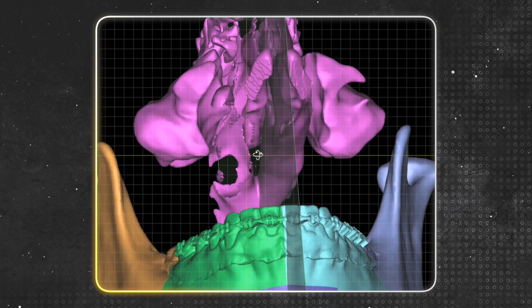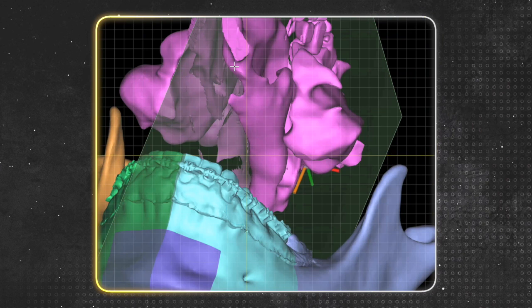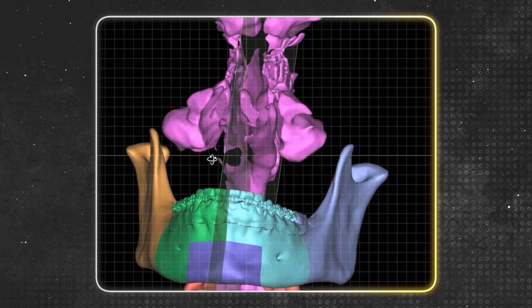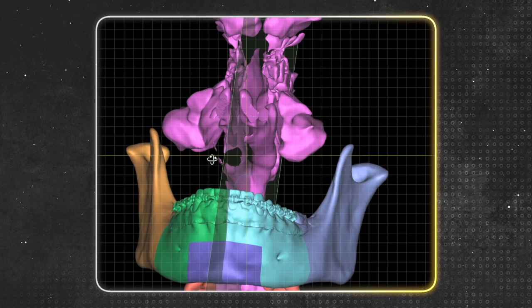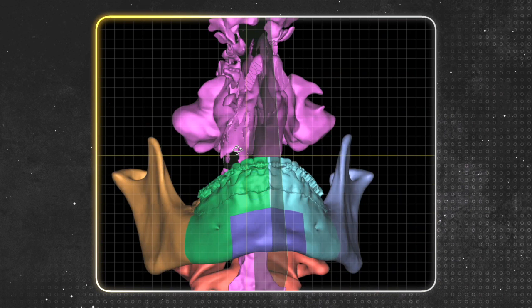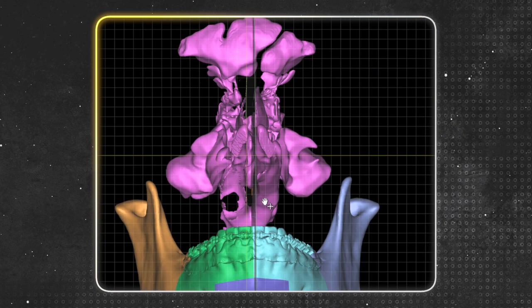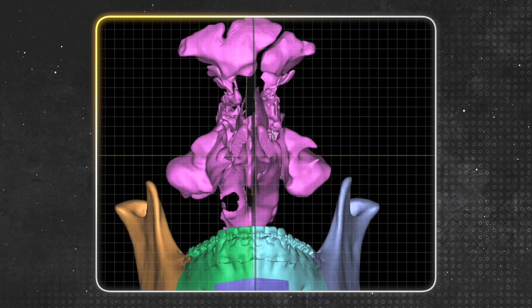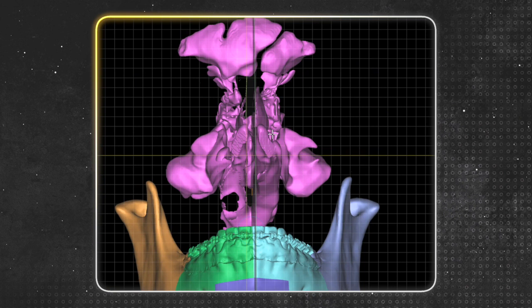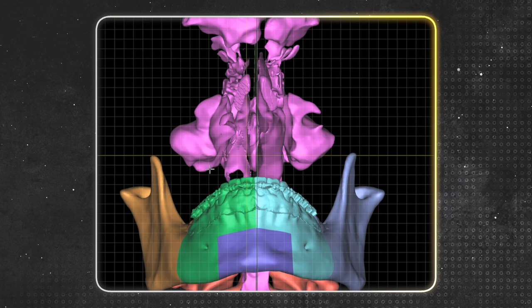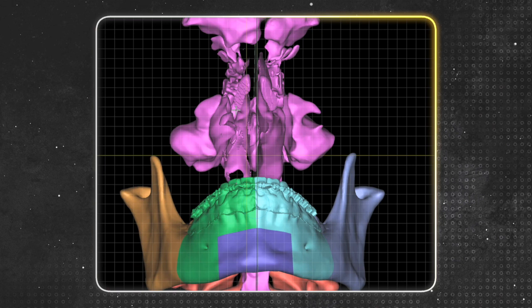When you look at her right nostril she has no airflow at all. The left side has got air but the right side has none. Could she have had a respiratory infection at the time of the scan? Well, here's another sign — do you see the sac sitting here, and this sac here? These are sacs that can only inflate if you're regularly breathing through your nose 14 times a minute. If there's no airflow while she's asleep, or airflow on only one side, one side will develop bigger than the other.